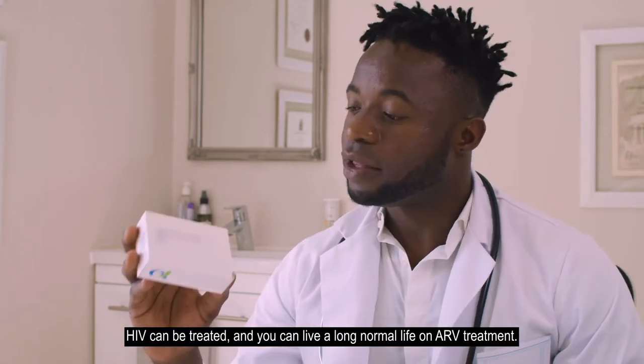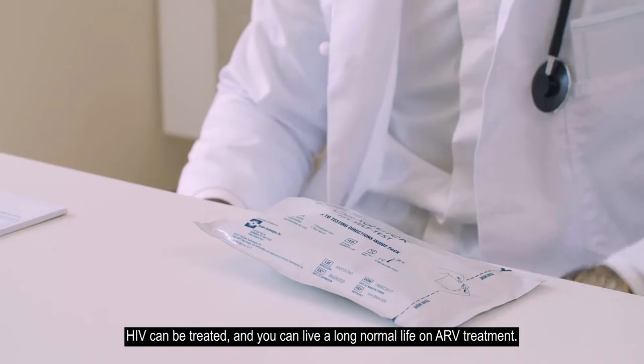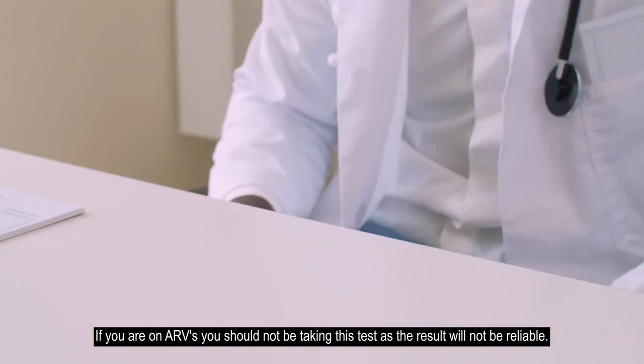HIV can be treated, and you can live a long, normal life on ARV treatment. If you're on ARVs, you should not be taking this test, as the result will not be reliable.